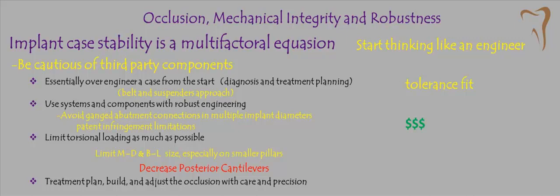The other thing is be cautious of third-party components. I'm not saying don't use them, because there are potential situations where they might even be better. However, there are only two reasons I would understand to use them. Number one, if the OEM company doesn't supply the parts that you need. And number two, it's dollars. You think you're saving money buying these other components, and in reality, the money you save going into a case may be a fraction of what you end up spending if parts fail and the warranties are void in the situation. So I would be careful of that.